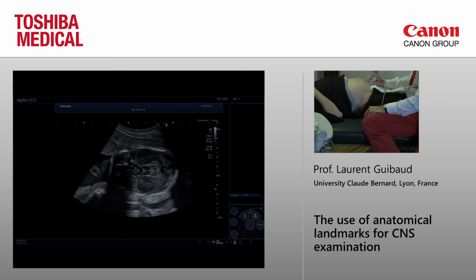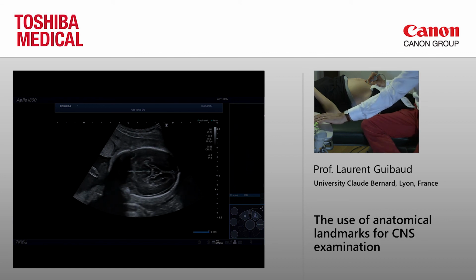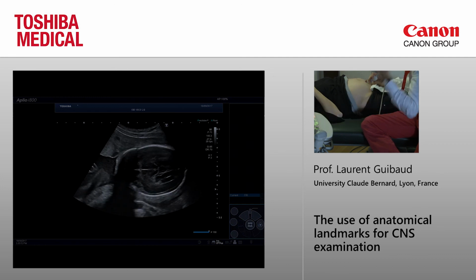So now you know that you have to measure the ventricle, and you know that you have a small depression, and I will show you here. In that case, it's not worthwhile to measure the ventricle because it's very, very thin. But if you have to measure, you see that the depression is here. So you measure from here to here. Okay. If you have any question, feel free to ask.